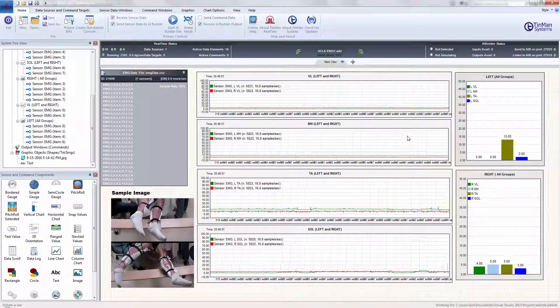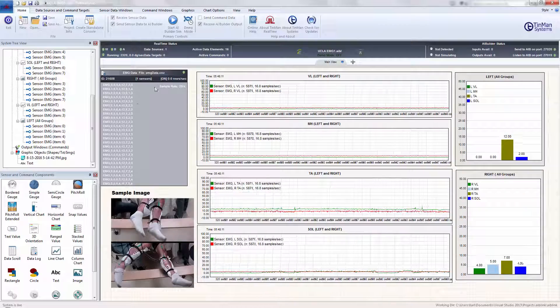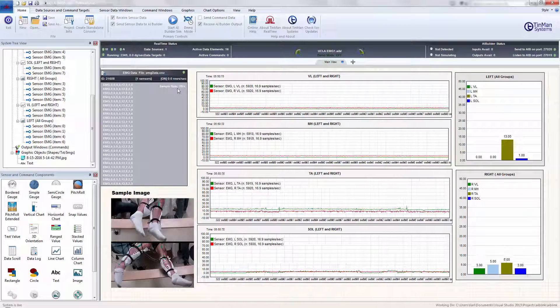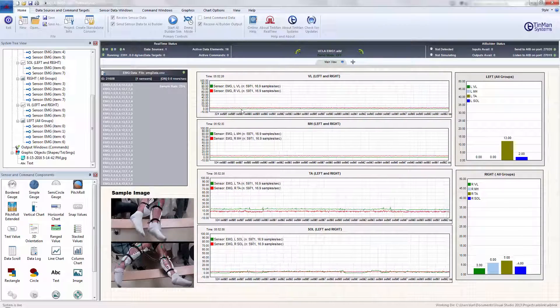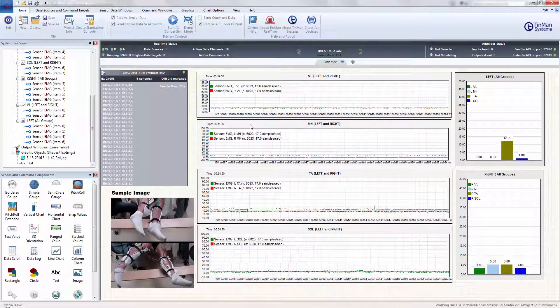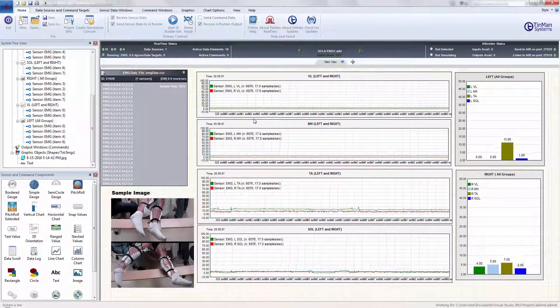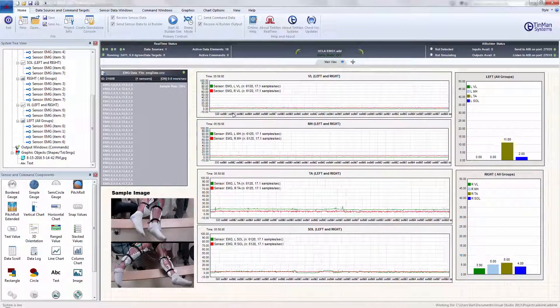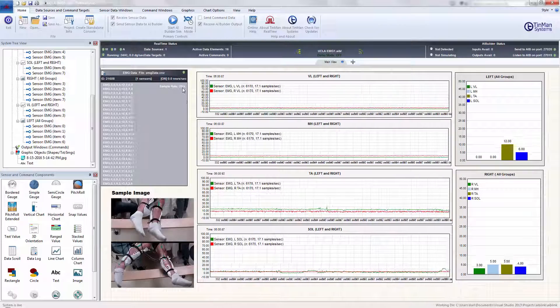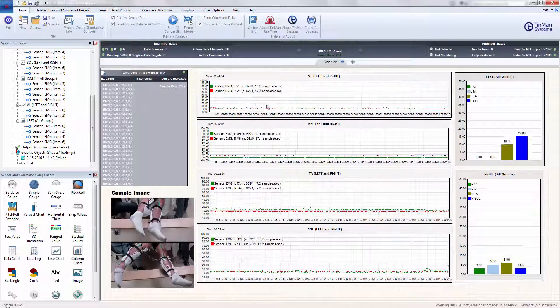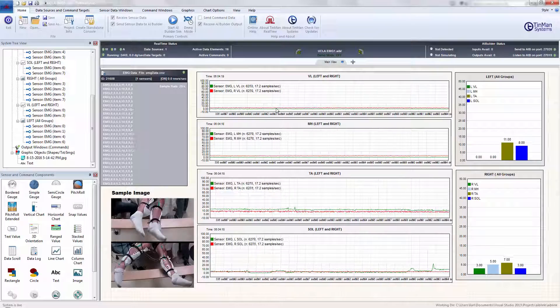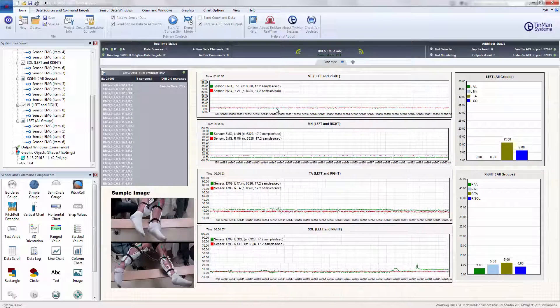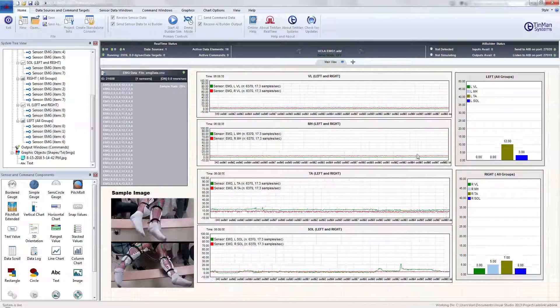And we could sit here for eight hours and watch this, or we could speed it up and set the sample rate to say 100 samples per second. And we would see the entire eight hour period in a two hour period. And then we could go to 200 samples per second and that'd be one hour. And we could go much faster.